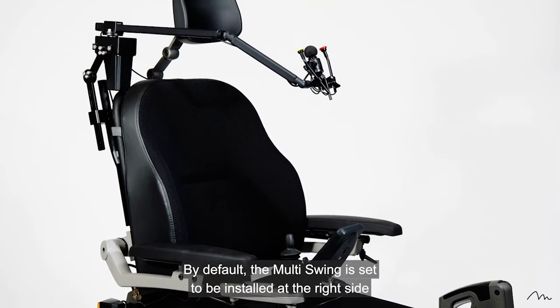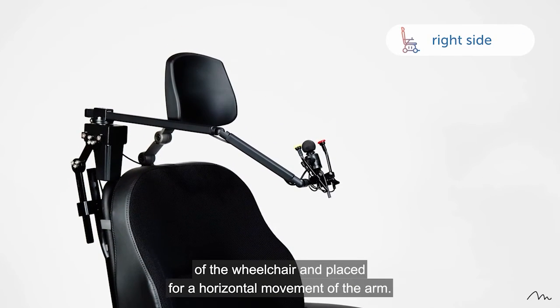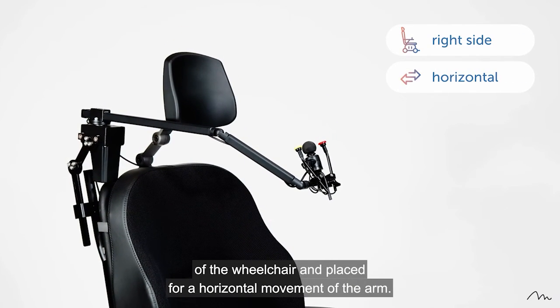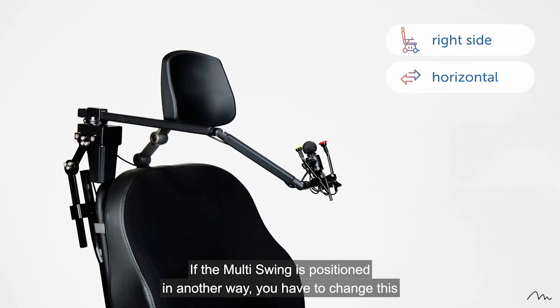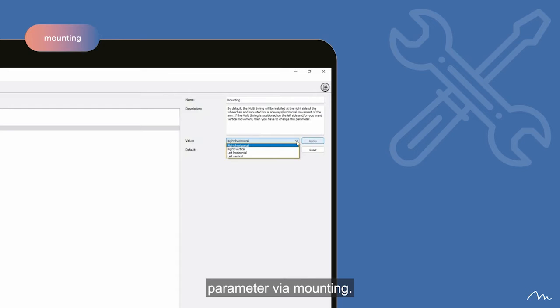By default, the multi-swing is set to be installed at the right side of the wheelchair and placed for a horizontal movement of the arm. If the multi-swing is positioned in another way, you have to change this parameter via mounting.